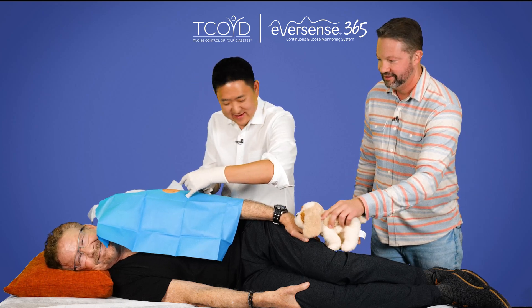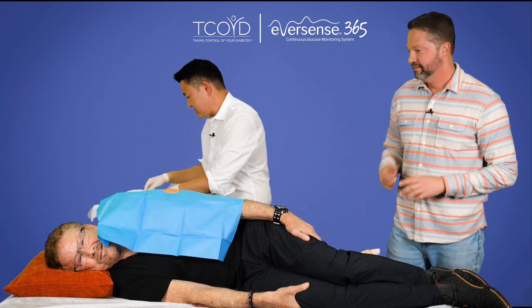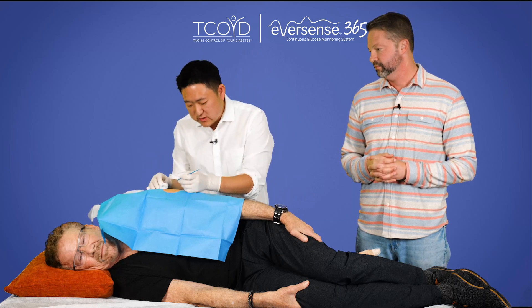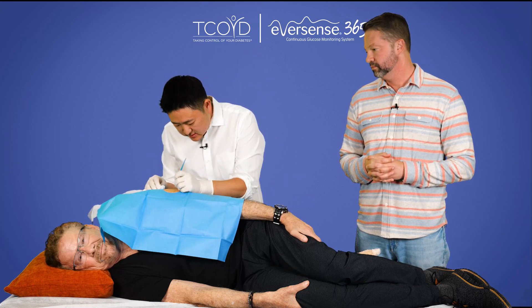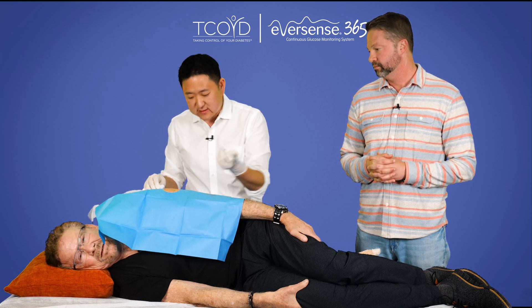And I'm going to caution you, Steve, that this is where you're going to feel a little bit of a pinch and a burn. This is where the numbing medication kicks in. This is where Mr. Barkington really earns his money. Did you do it yet? Yep, it's the numbing medication's in. So we gave a few minutes for the lidocaine to kick in, and we're going to do a quick test of sensation. Steve, does this feel pokey at all? Does it feel sharp or just pressure? Just pressure. Perfect. No pain.